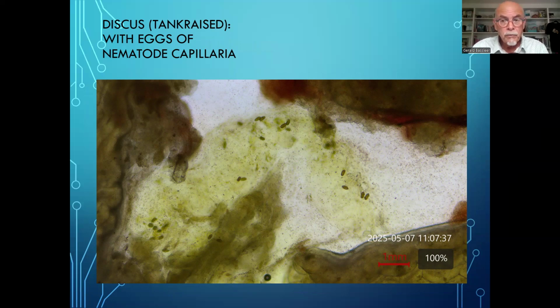Why not? Those are free samples for examination without hurting or damaging the fish, but make sure you take those excrements fresh within the first minutes. Otherwise, they're going to be invaded with tetrahymena and other protozoa that like to eat excrements in the aquarium.